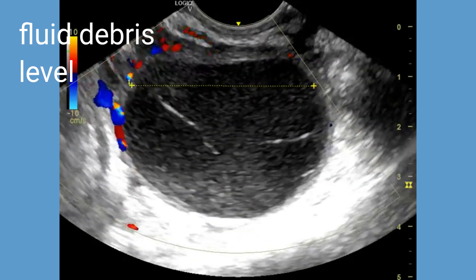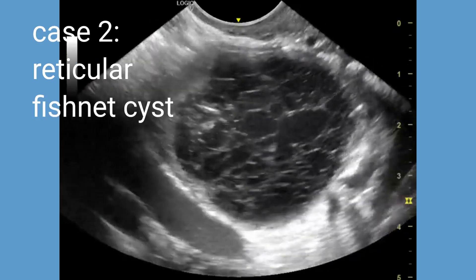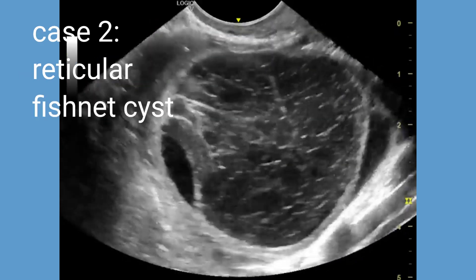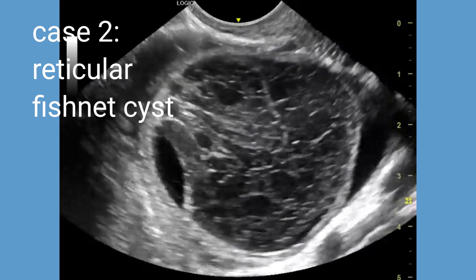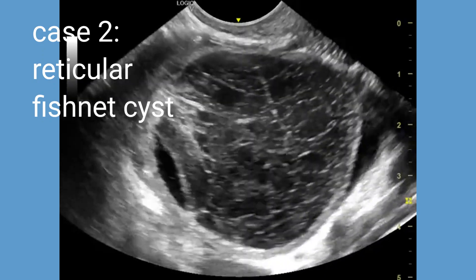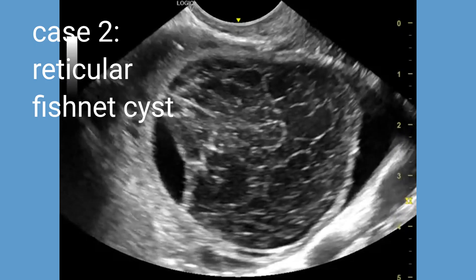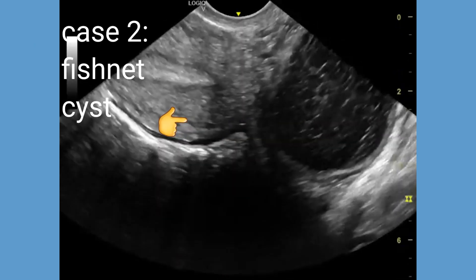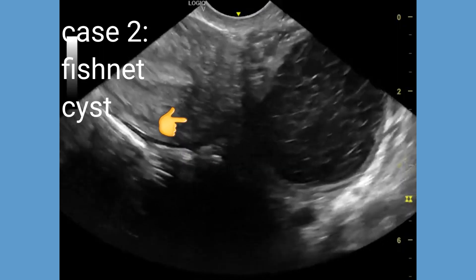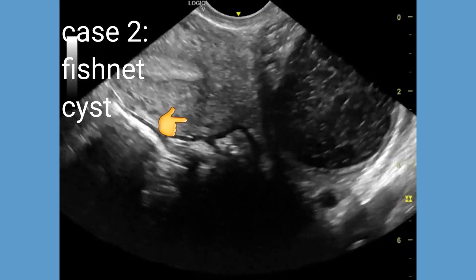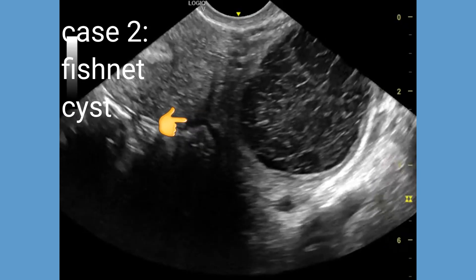Next, we come to the fishnet appearance in hemorrhagic ovarian cysts. The appearance of a fishnet, also known as a reticular or lace-like pattern, is a term used to describe the internal structure of some types of hemorrhagic ovarian cysts. The fishnet or reticular appearance is characterized by a fine mesh-like or lacy pattern of septations — internal walls — within the cyst.